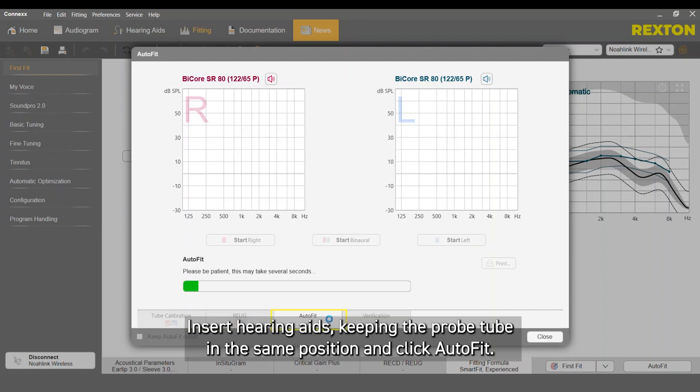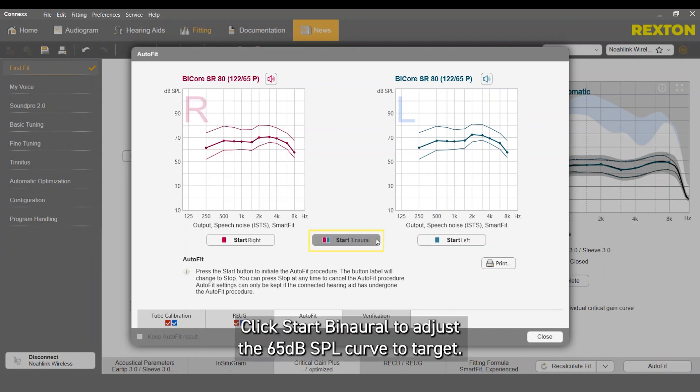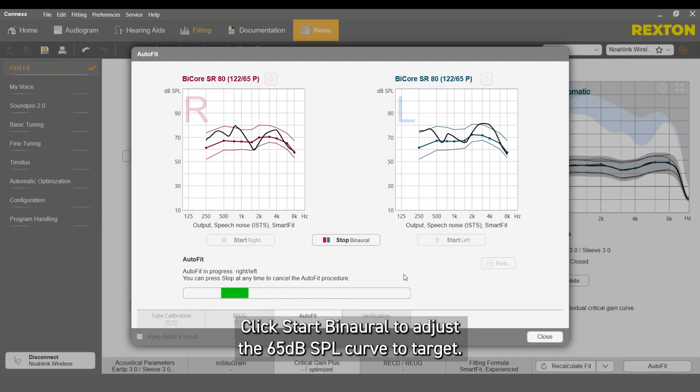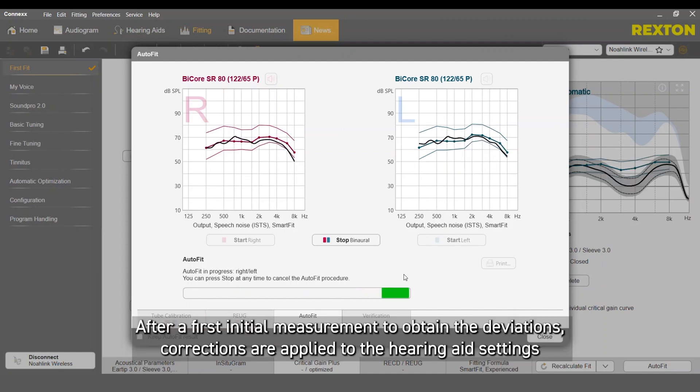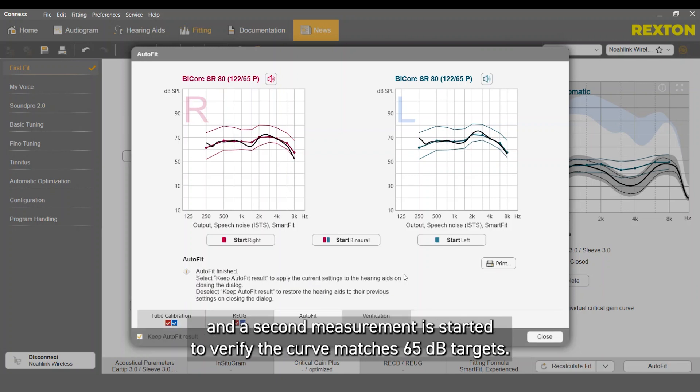Insert hearing aids, keeping the probe tube in the same position and click AutoFit. Click Start Binaural to adjust the 65 dB SPL curve to target. After a first initial measurement to obtain deviations, corrections are applied to the hearing aid settings and a second measurement is started to verify the curve matches 65 dB targets.